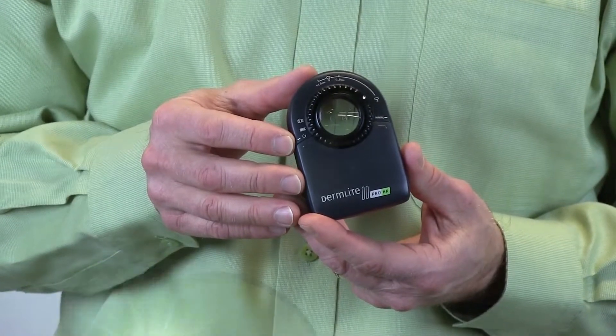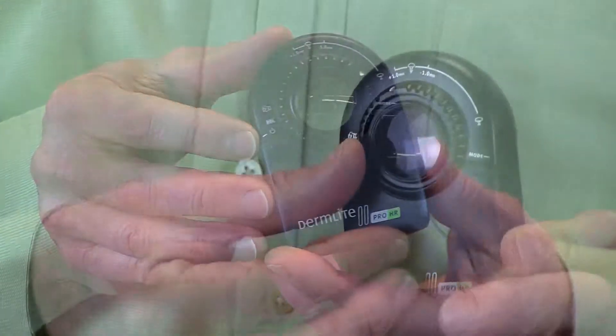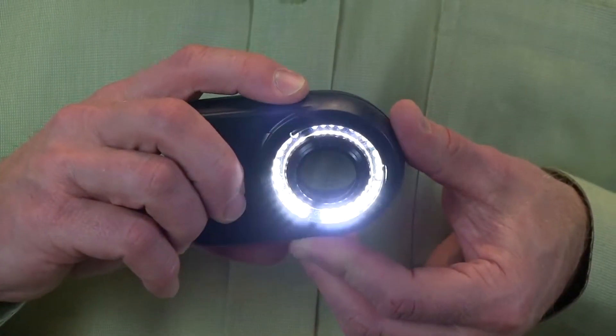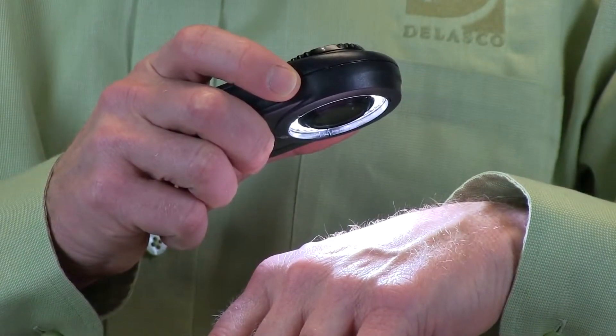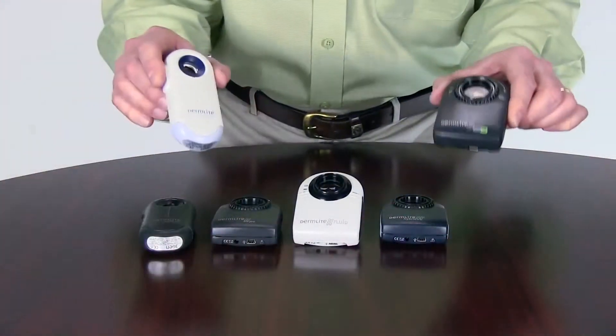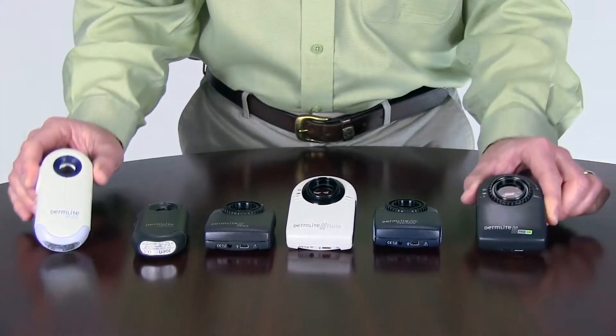The DermLight 2 Pro HR is part of the second generation of DermLights. The body shape changed slightly, more lights have been added, and a key feature is the larger viewing area. The lens is a 10x25mm, a full 10mm larger than the original design.